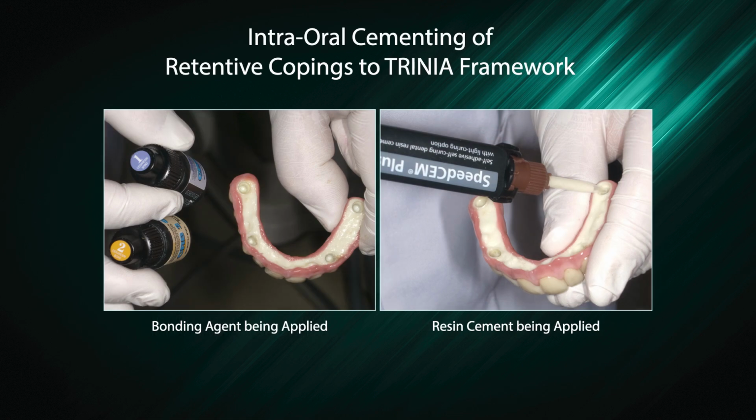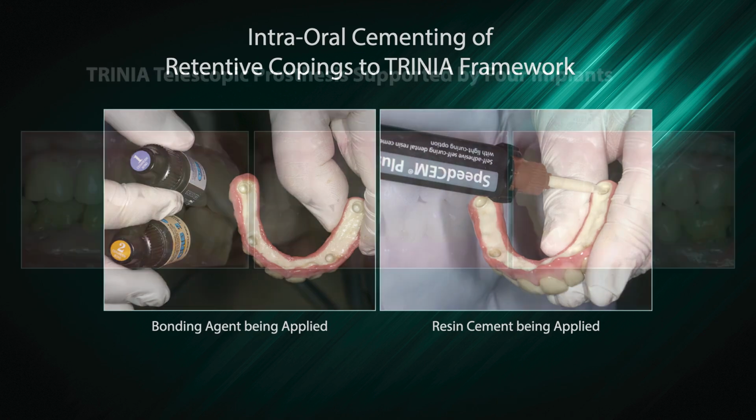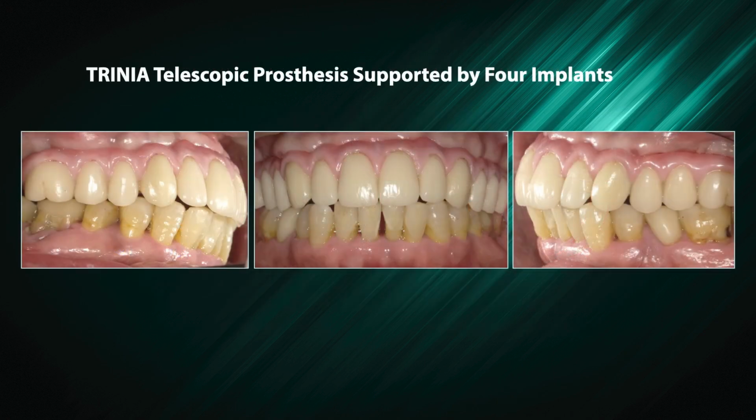Intraoral cementing of retentive copings to TRINIA framework. The image on the left shows the bonding agent being applied. The image on the right shows the resin cement being applied. TRINIA telescopic prosthesis supported by 4 implants.